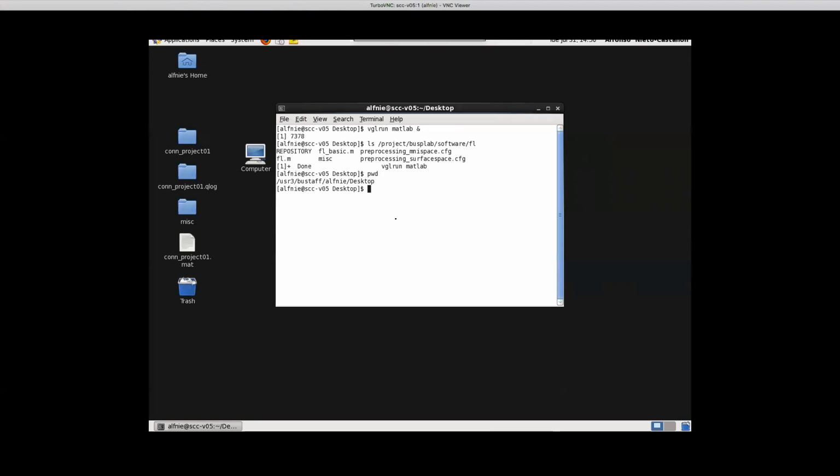But in that subject space, has that surface already been interpolated so that there is a literal one-to-one mapping from one vertex to another, or are there more or fewer vertices, say, in the subject space, so that any given vertex might map to two vertices in the FS average surface?